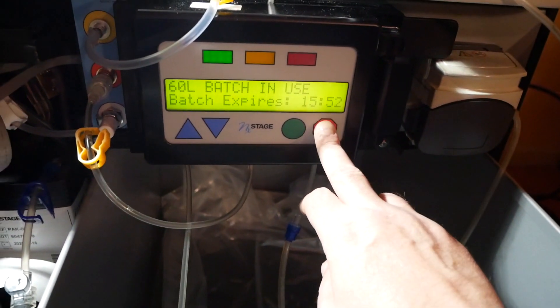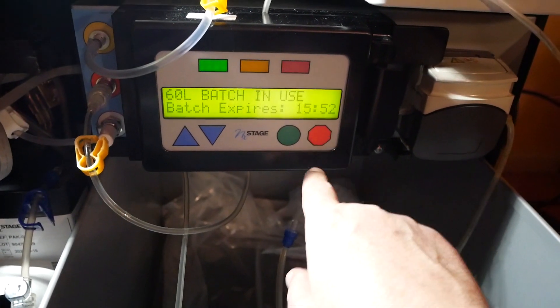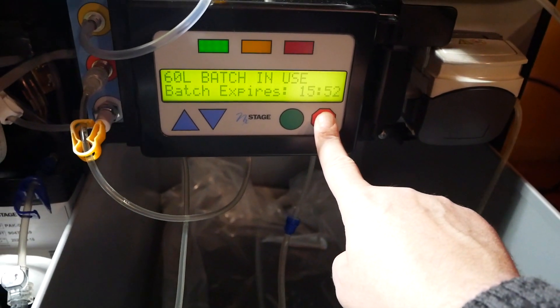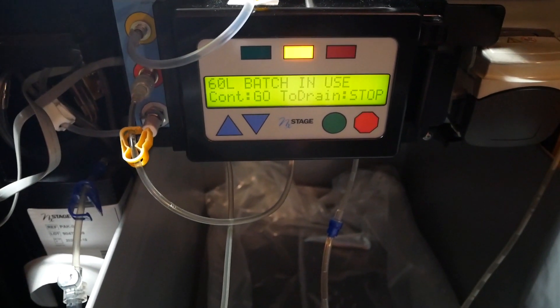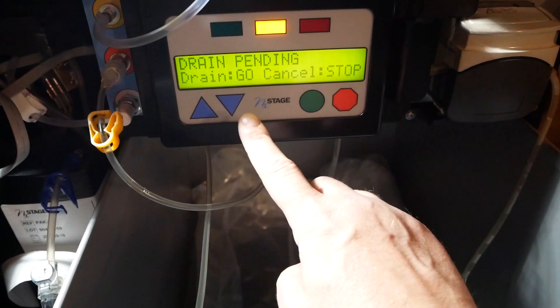The first thing we're going to do is tell it we want it to stop by holding the stop button - right here on the corner - down for about two to three seconds. Then it'll pop up on the screen saying continue, go, or drain stop.